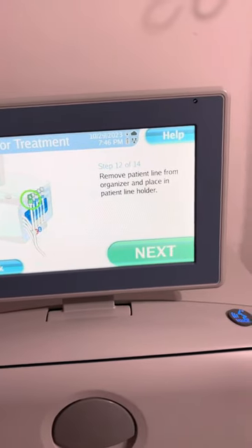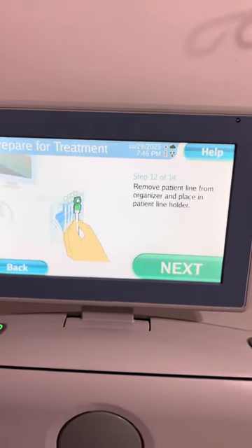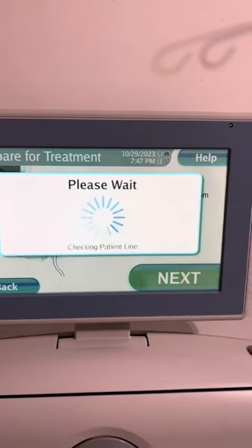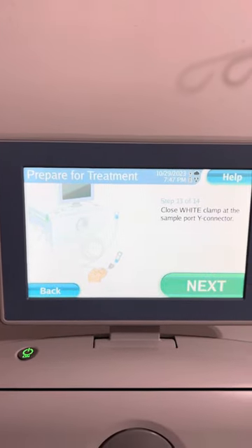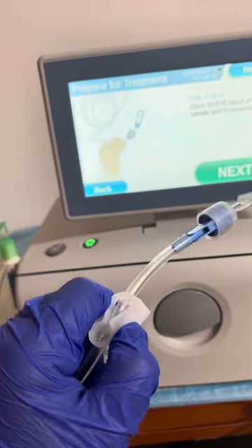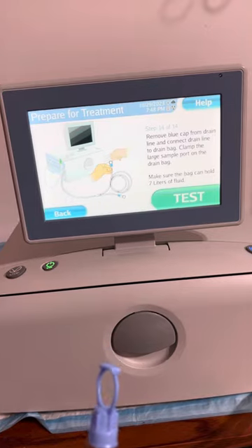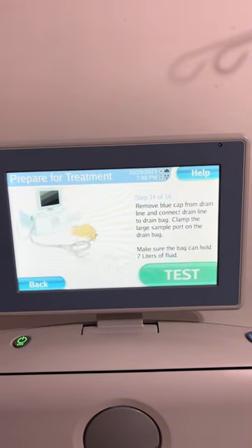Remove patient line from line organizer and place it in patient line holder. Clamp on the drain line sample port. Remove blue cap from drain line and connect drain line to drain bag. Clamp the large sample port on the drain bag.